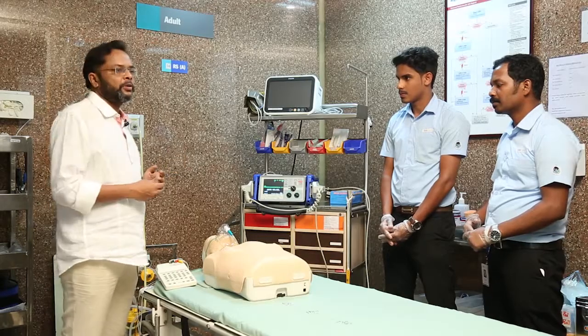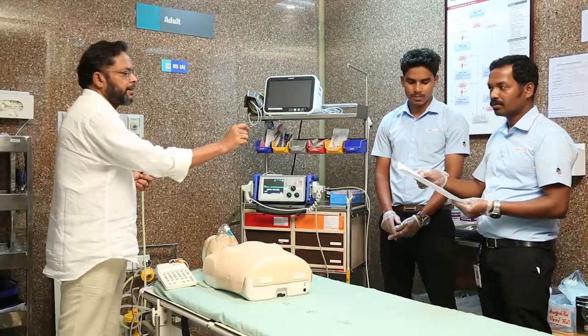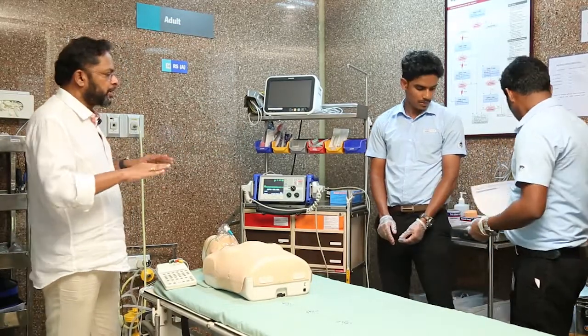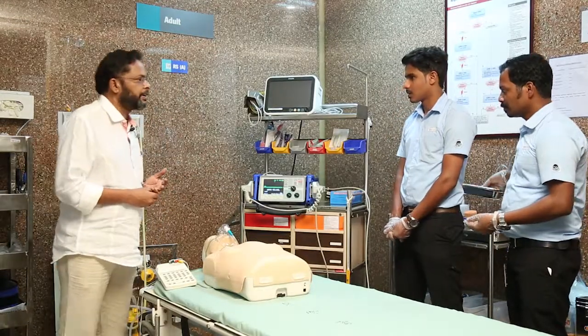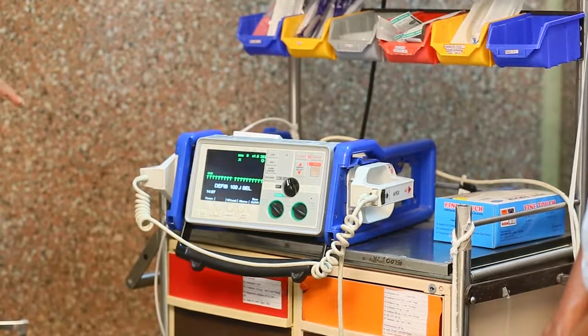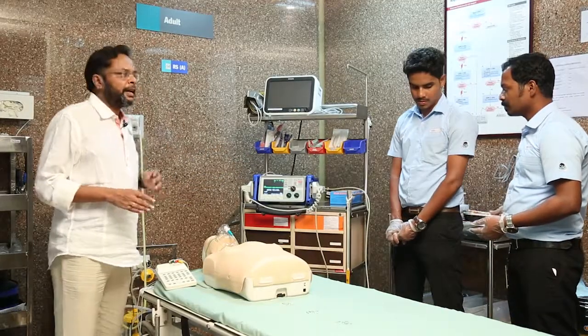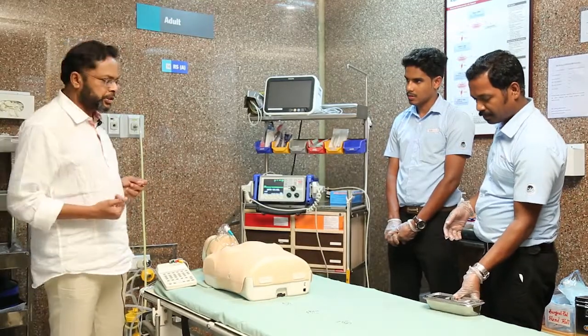Cardioversion is slightly different from defibrillation. We must complete certain formalities first: obtain signed consent from the patient, ensure the crash cart and all resuscitation equipment and emergency drugs are nearby, and explain the procedure to the patient if they are conscious.